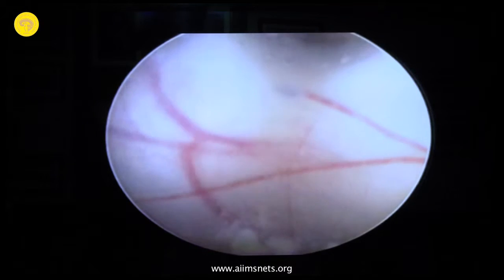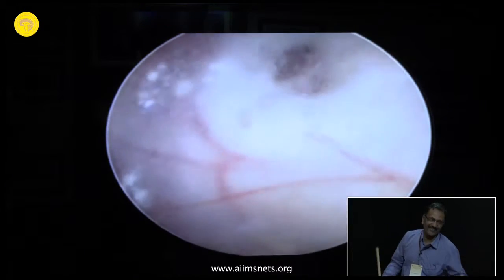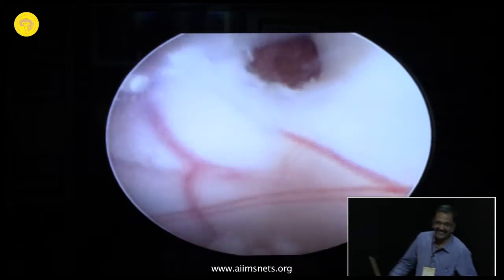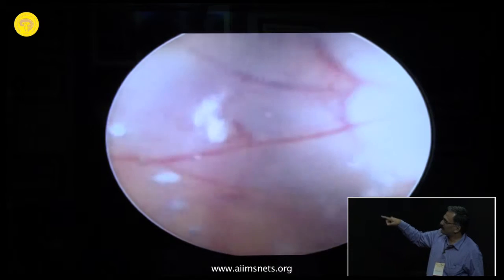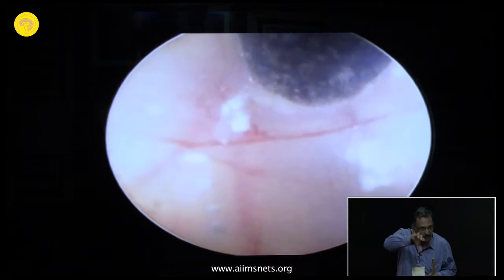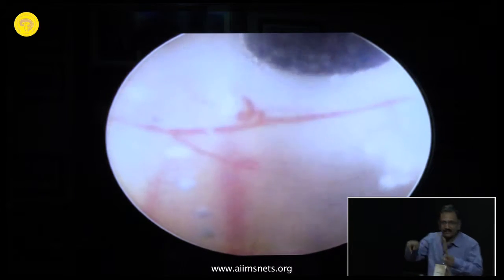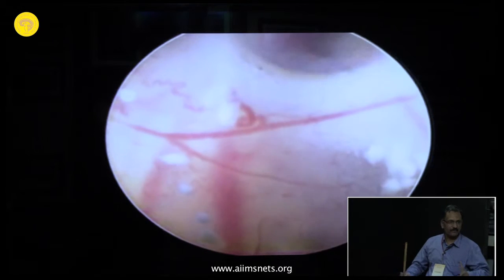You have to be very, very careful here, right? And it's a little matter of luck also. To be very honest, you don't know where you are. But once you do that, then you see. You can actually make a second fenestration there. Just make one or two fenestrations. You can combine all of them. Then you have the whole cisternal space in front of you. Always make a double fenestration and go in.